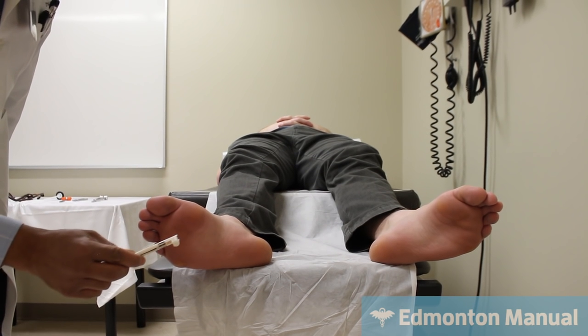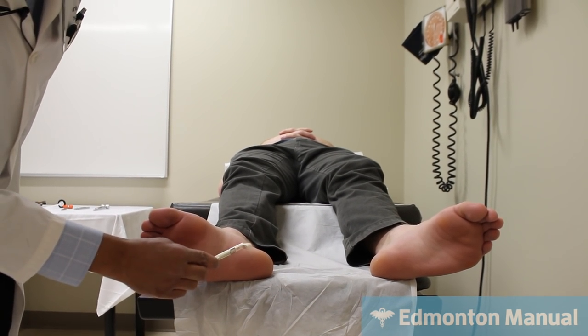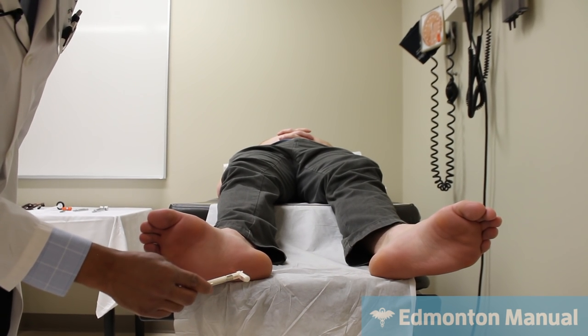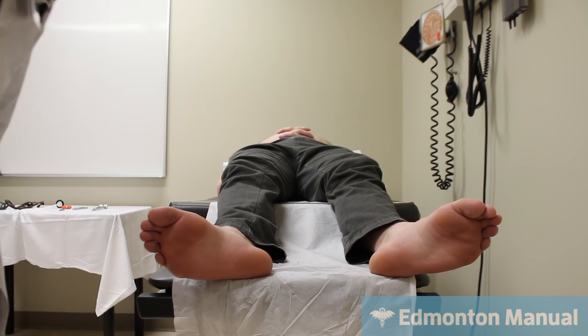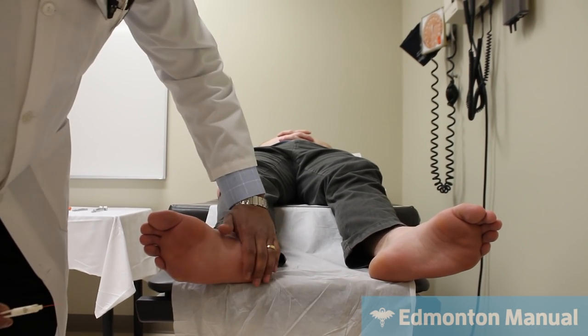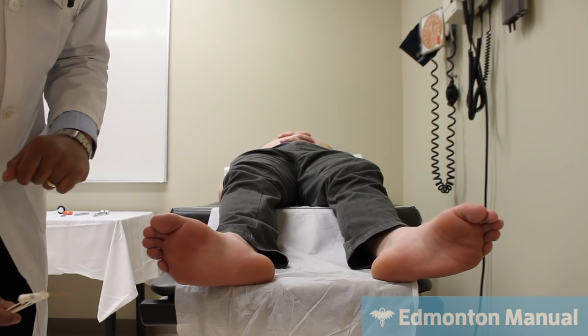Yes, same. Yes, same. Yep. Yes. Okay. And again, you have to be very careful. If people have a huge callus on their heel, that will decrease sensation. You should not be testing that.